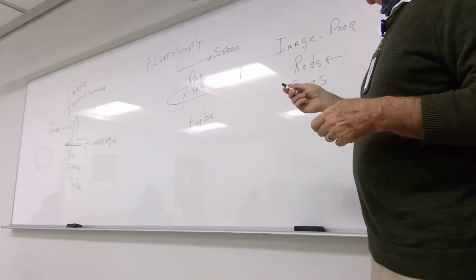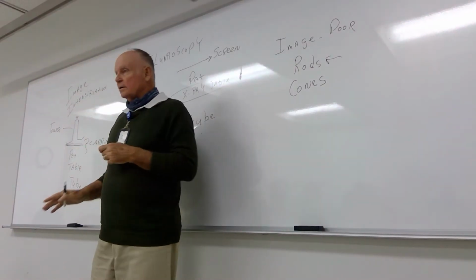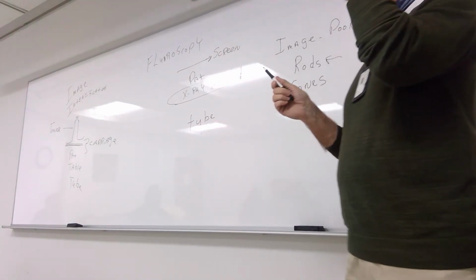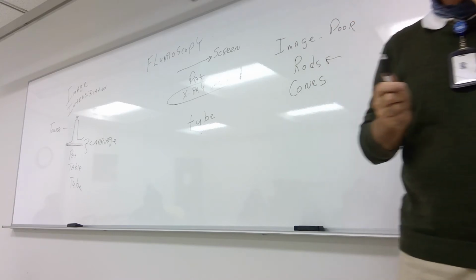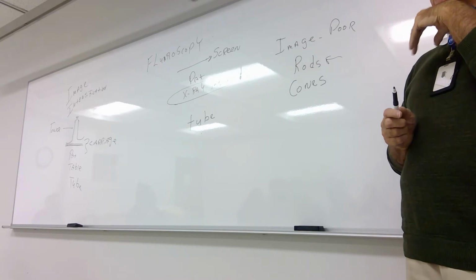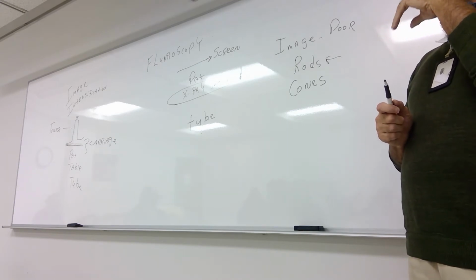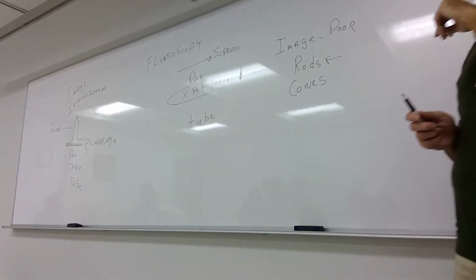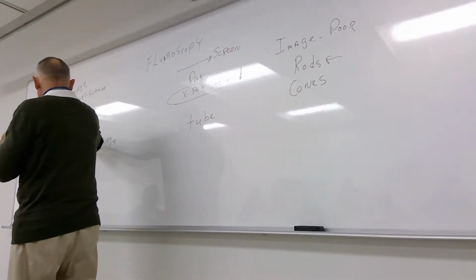Now, these tubes that we use here, when you make a regular X-ray exposure, it's a split second. These tubes in image intensification units are on for minutes. They're special tubes to take a lot of, what's the byproduct after radiating? Heat. They're made that way, so they're on continuously. It's a continuous beam.